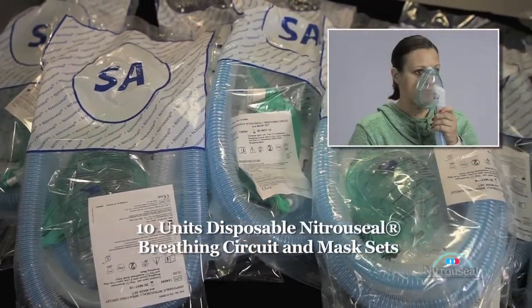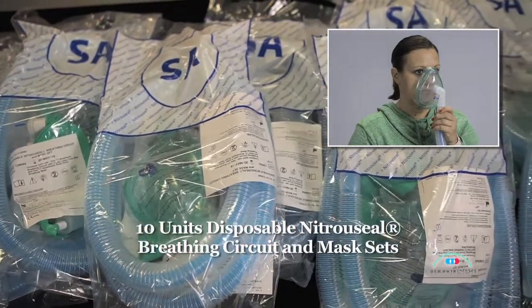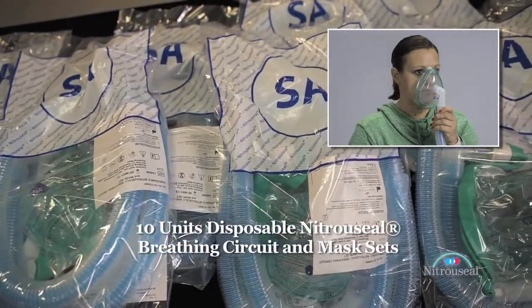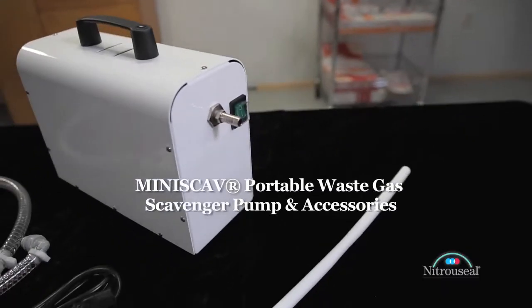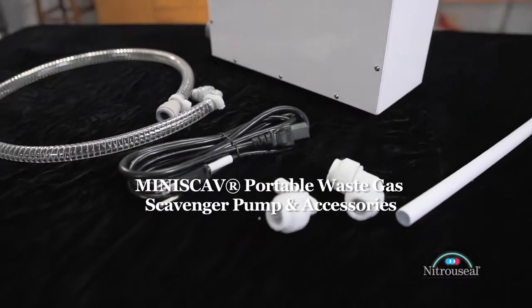The medium-sized box contains an initial supply of 10 units of disposable single-use NitroSeal breathing circuit and mask sets. The smallest box contains the Mini Scav portable waste gas scavenger pump with its associated accessories.